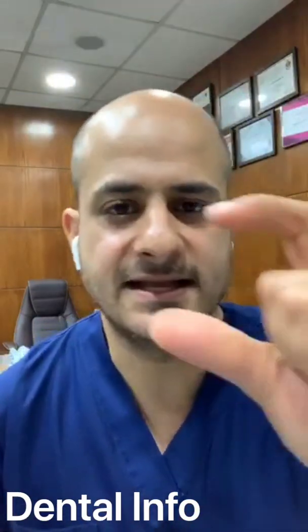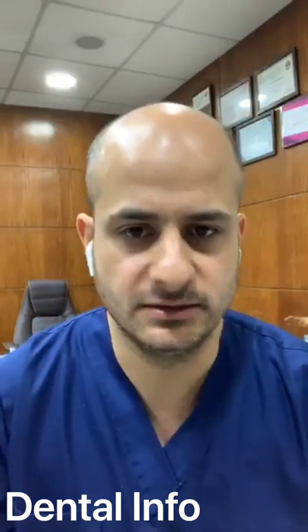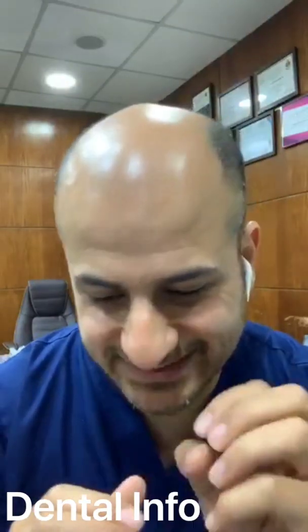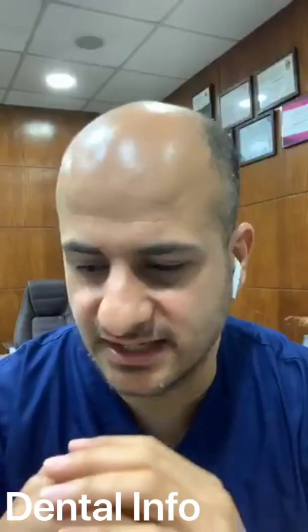Okay, it's like a small device. You can cut any gutta-percha cone to any tip size you want, and with that you can measure how much you prepared the canal. Otherwise, you just have to make a try. Sometimes I make two to three X-rays just for the cone fit. It's not wrong. That's totally right, because tug-back is a big issue. It's not a small detail. It's a very big detail. Tug-back is not at all a small detail.